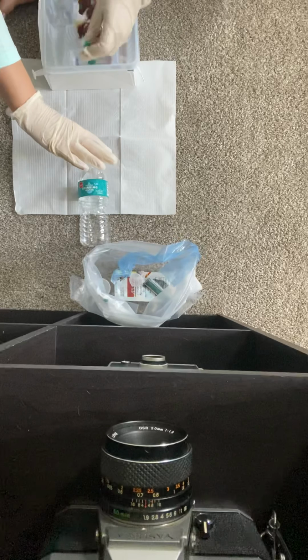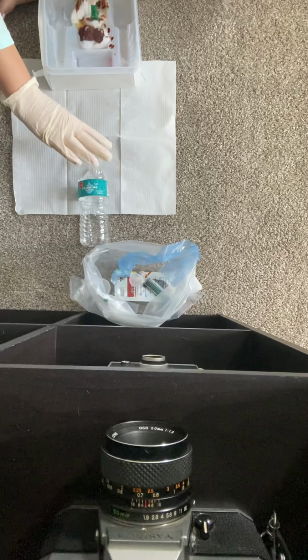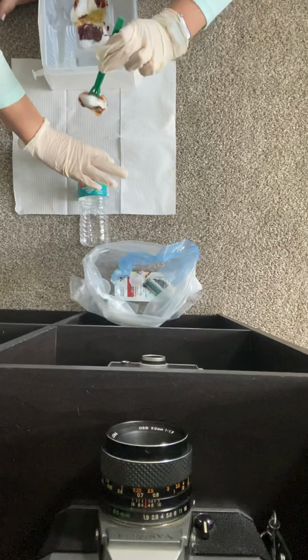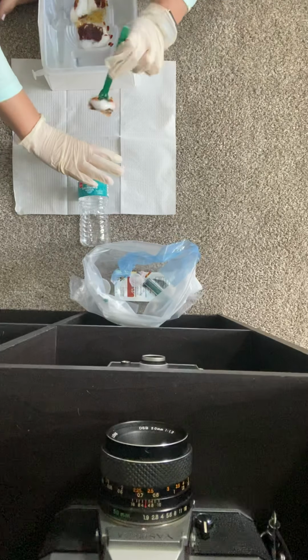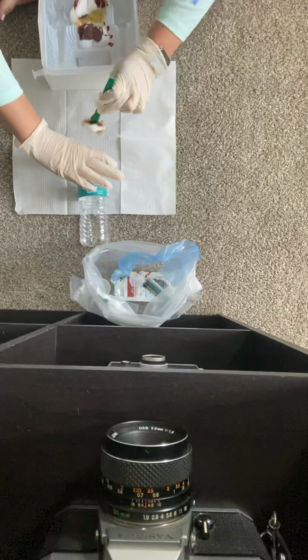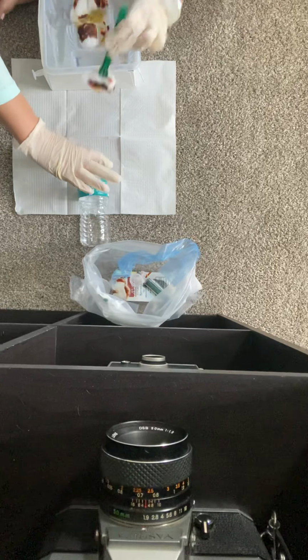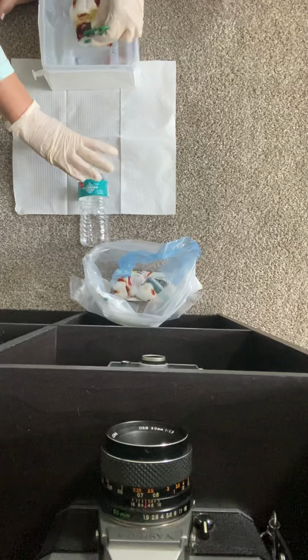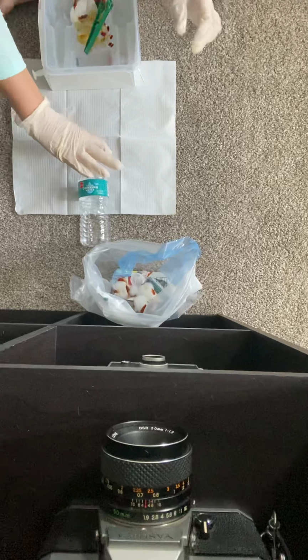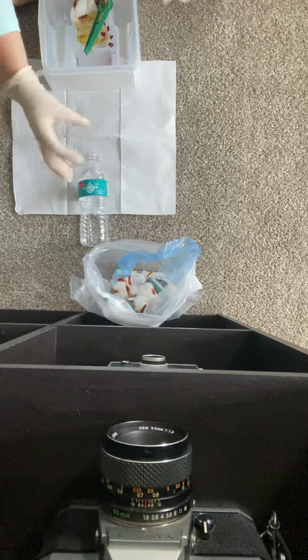Then I'm going to take my dominant hand and do one swipe. I'm going to do the center first and then get rid of that. So I already wiped that one, and this is still keeping it open. Then I'm going to do one side, get rid of it, do the other side and get rid of it. So I did three.